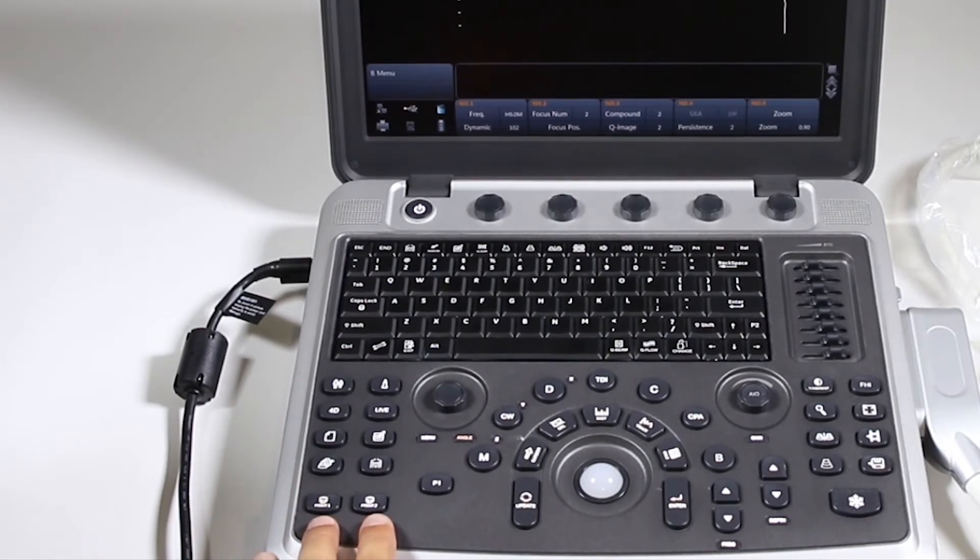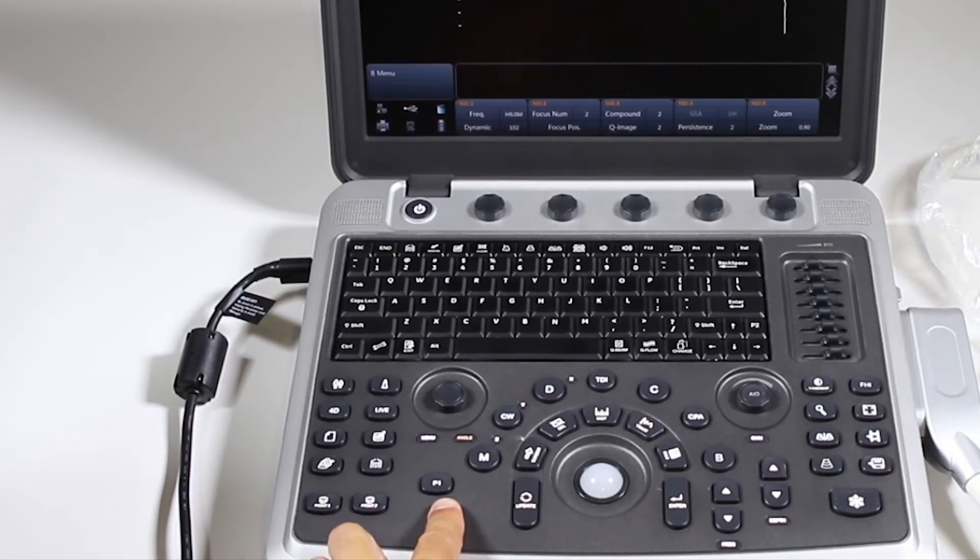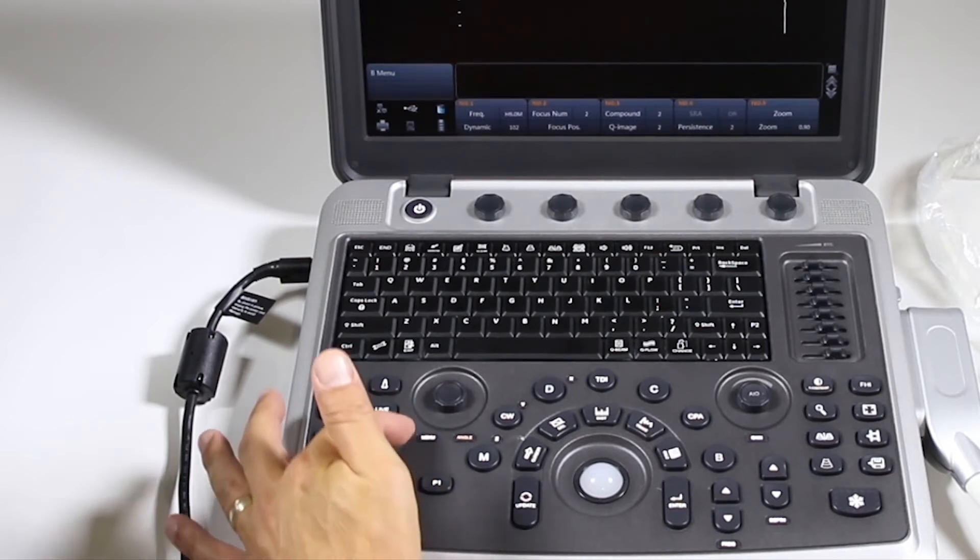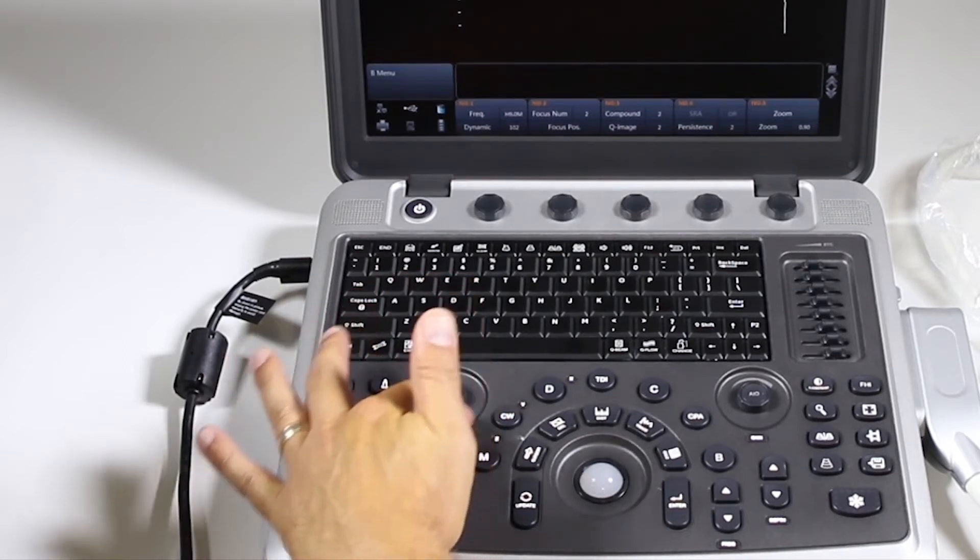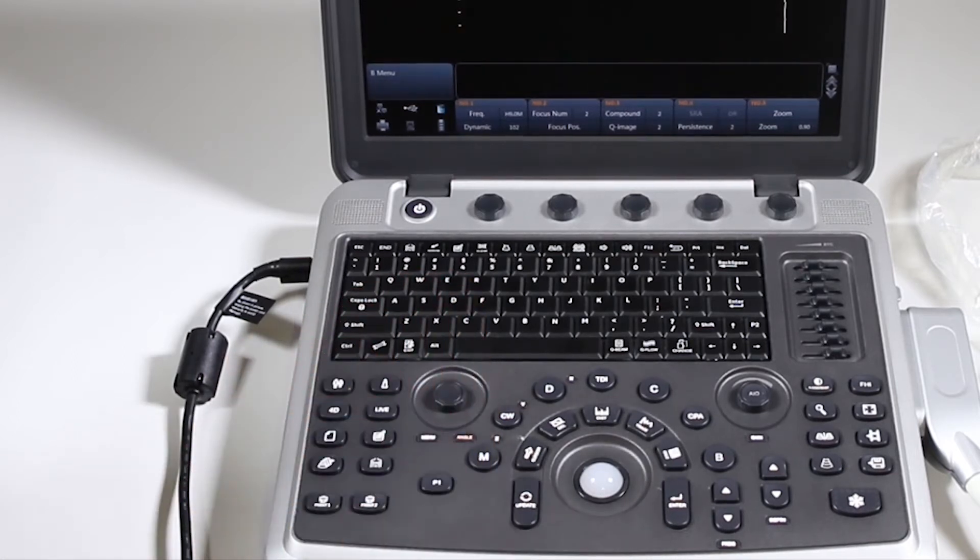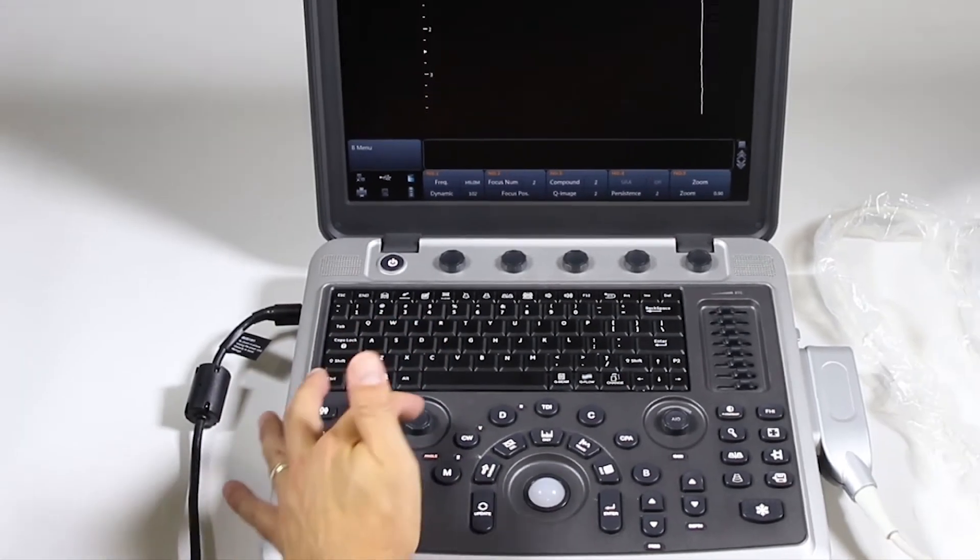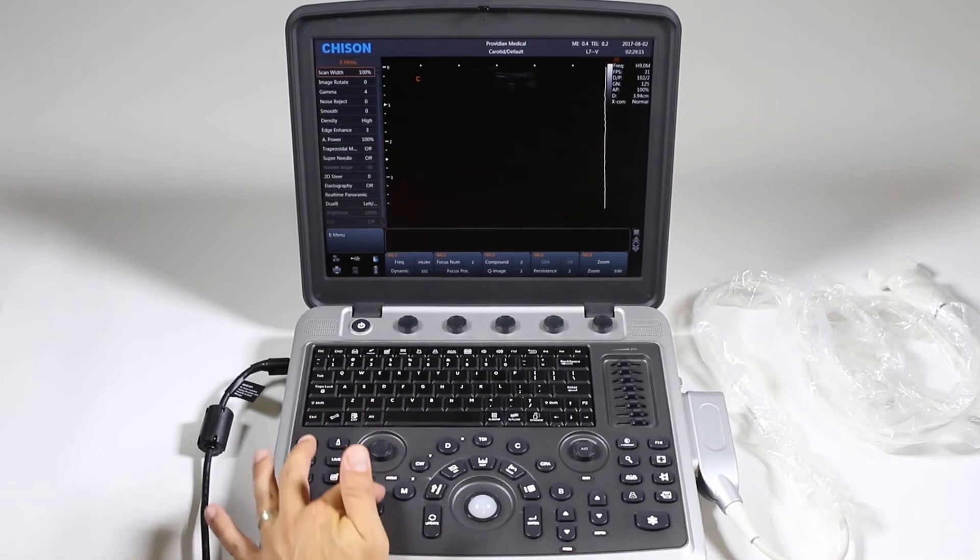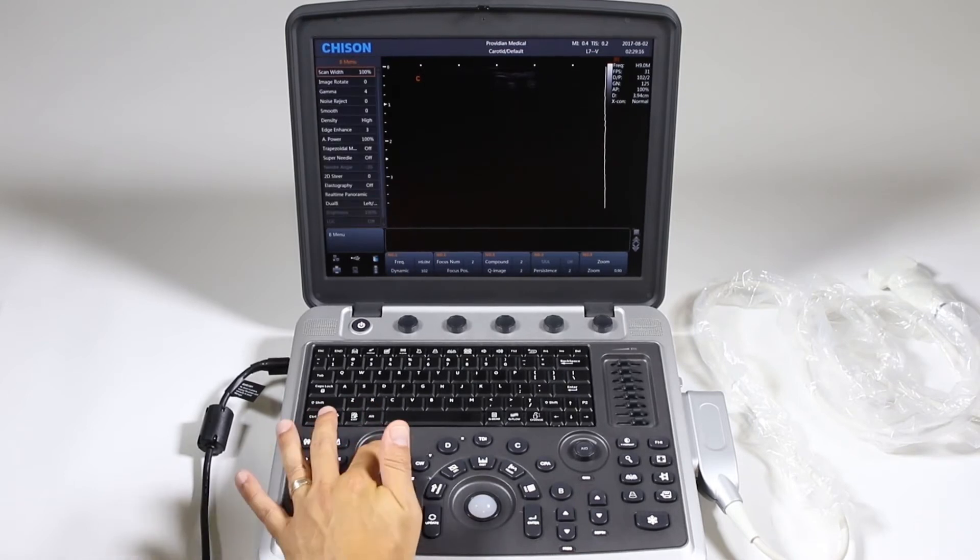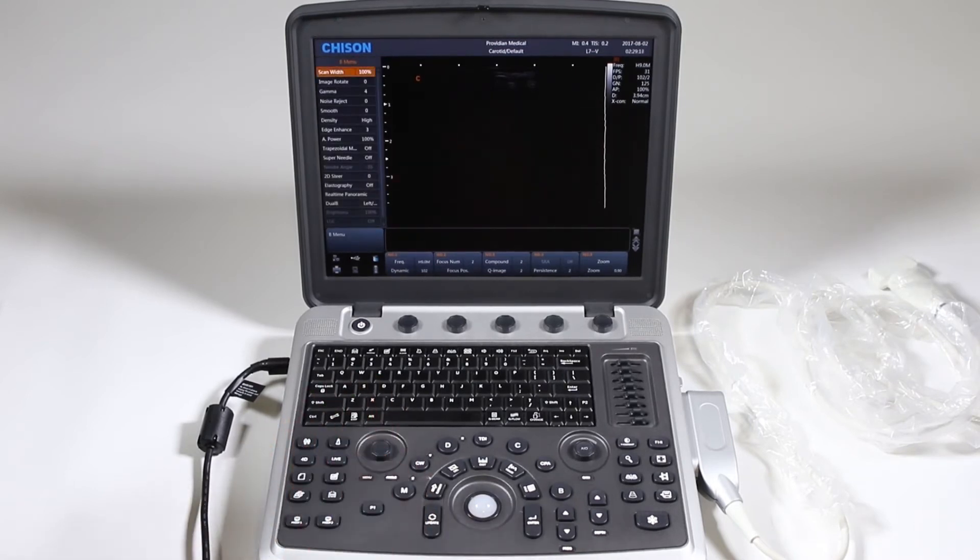You have two print functions here. A P1, which is a programmable print button. This knob here is a multifunction knob. You can push it down and switch between menu and angle.